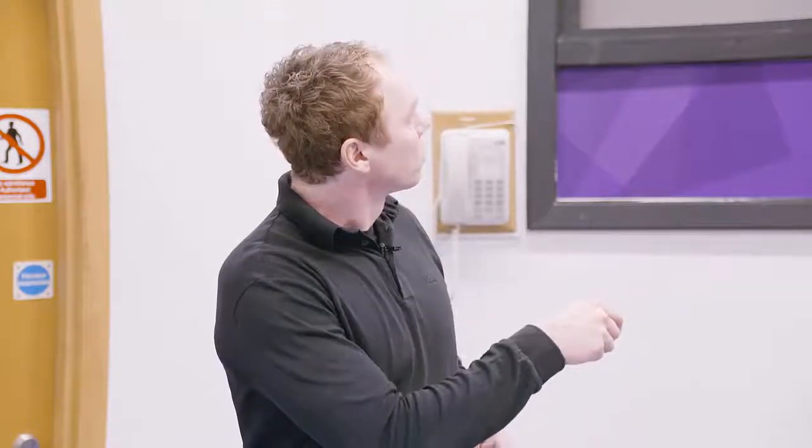So the people that have some issues with the biceps femoris form one group. The ones that have issues with calf muscles, for example, form the second one. And when they're doing the strength and conditioning training, one part of the training, maybe just a small part, will focus on these specific needs based on the TMG measurements. Some strength and conditioning coaches go into details and design an individual program for each subject that will focus on all of these issues. It's just up to the end users. But it's a very fast way to see the whole team and to see where the issues are.